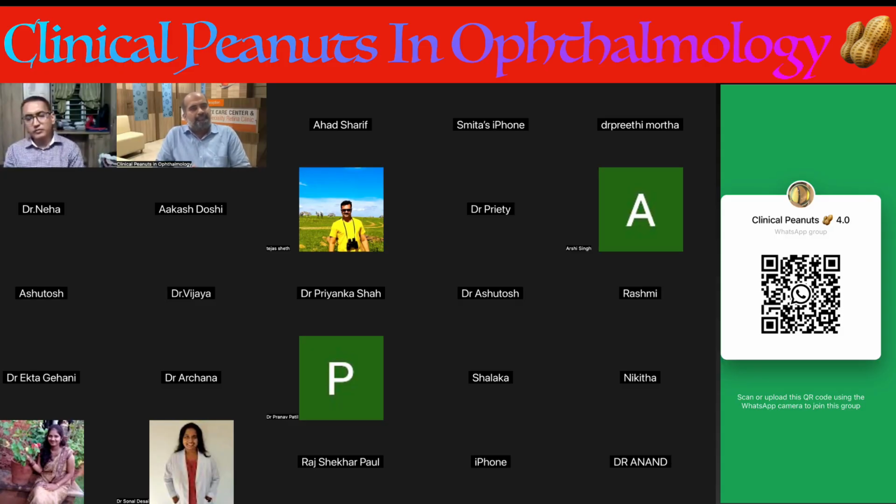They make a difference because whenever you are doing coaxial, you are taking only one side port incision. So the surprises in terms of judgment are less, because the fewer the incisions over the cornea, the better your calculation and predictability.